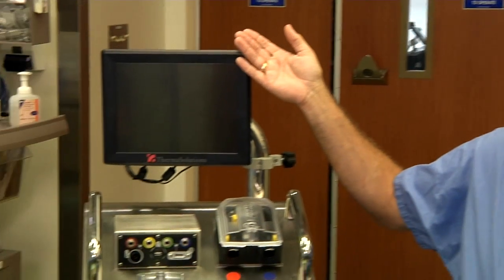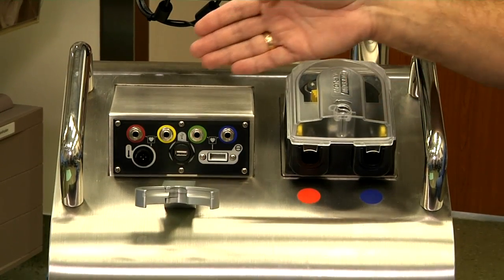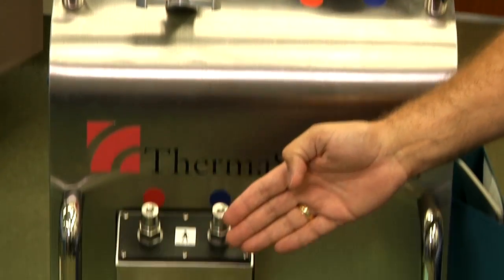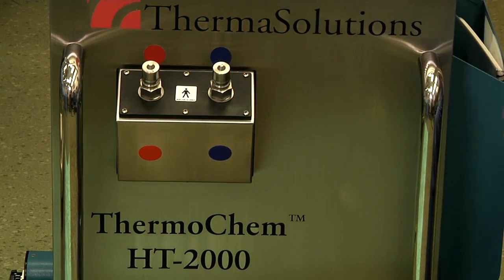First we'll go over the components of the device. We have the screen, we have the pump, we have the sensor connector panel, this is the heat exchange bracket, and this is the water bath hookup. These are the pieces of the front of the device that we'll utilize throughout the procedure.